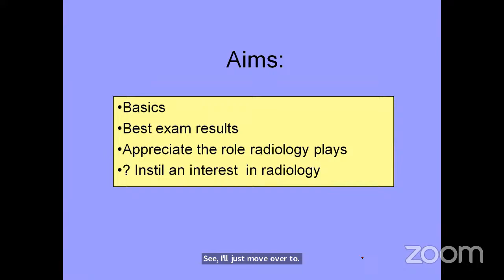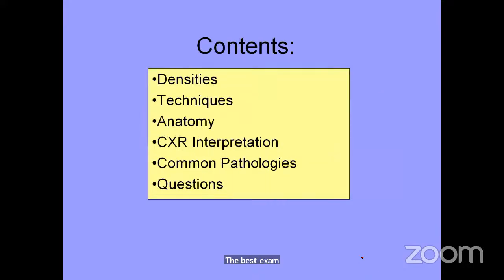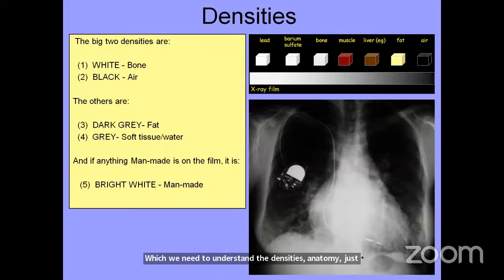So the aims are to learn the basics, get the best exam results, appreciate the role radiology plays, and instill an interest in radiology. The contents which we need to understand are the densities, technique, anatomy, chest X-ray interpretation, common pathologies, and of course, some questions we'll be having.